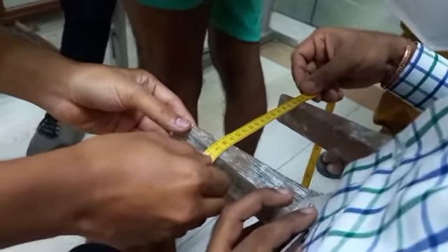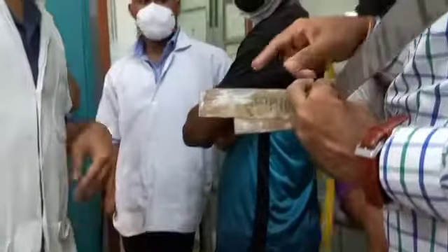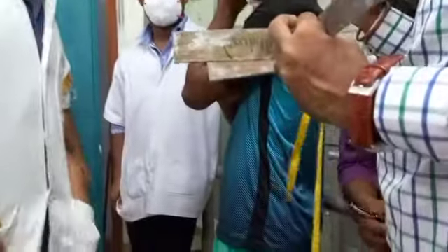This is 11.5. Okay, 11.5 centimeters. So this is our two measurements. One was our ml skeleton, another was our soft tissue ml that we have measured. And another AP was already taken that day. AP we have, right?